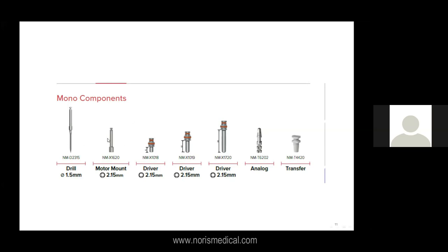Here you have a motor mount. By the way, I never use the motor mount. I always try to use the hand tool, and if I have no choice, to use the ratchet, because I still think that the tactile feeling in the hands and in the fingers is the most important.